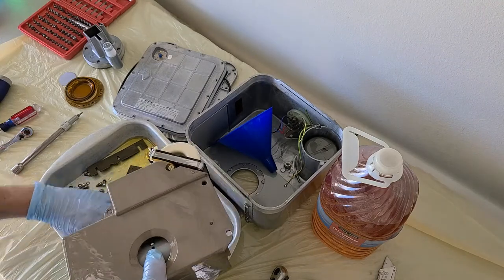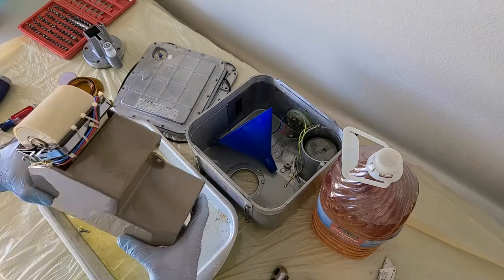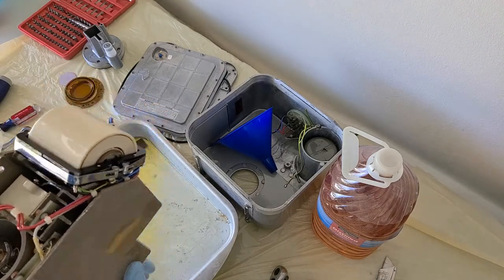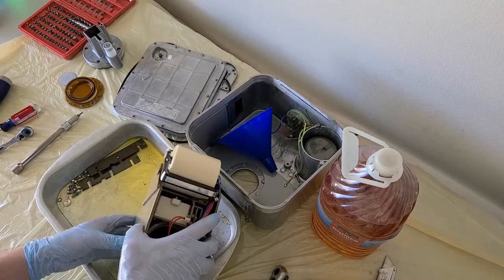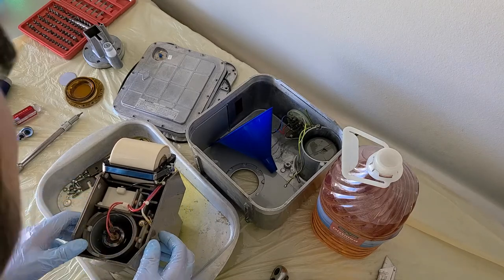Now let's take a look here at the actual assembly. So it looks like it's covered in this plastic. I don't know why. I think it's like Bakelite, some kind of durable plastic. I'm pretty sure that's what it is. All right, let's go ahead and find a way to get the tube out of here now.